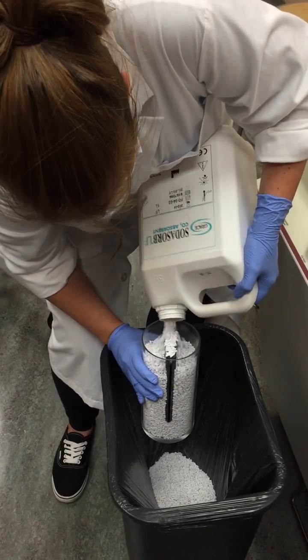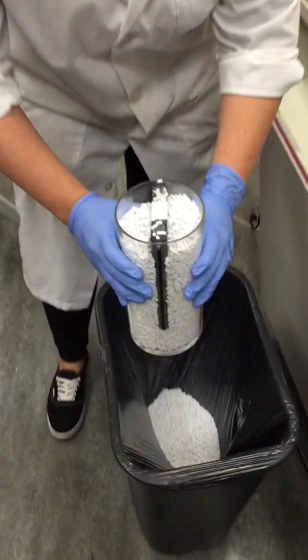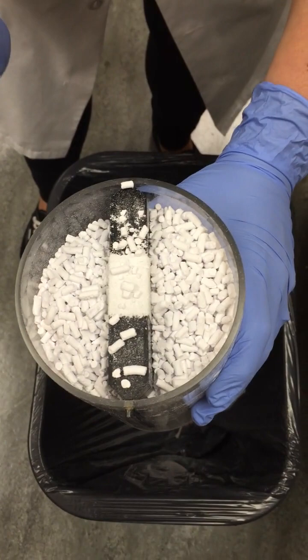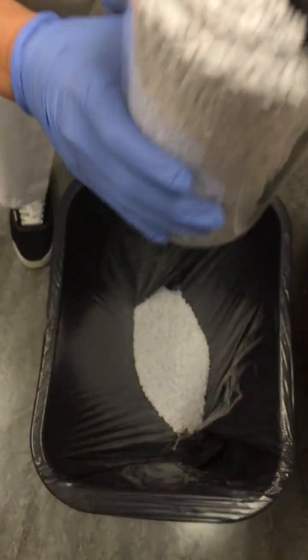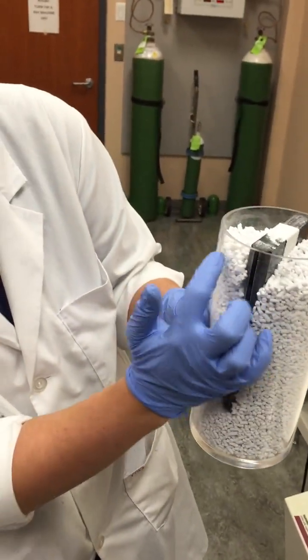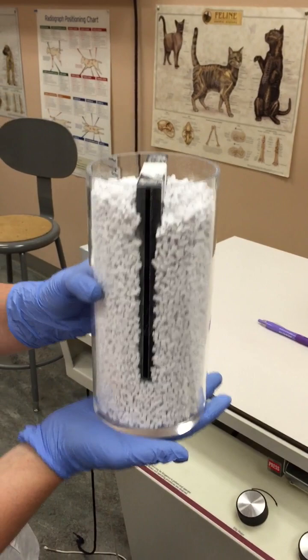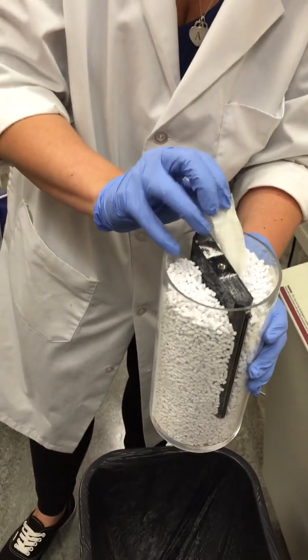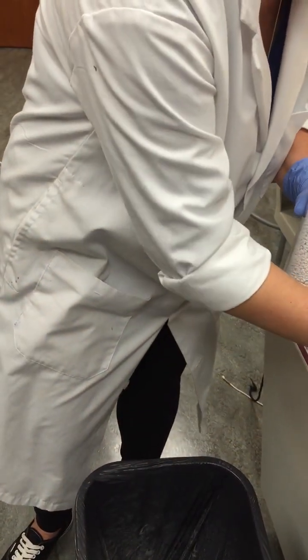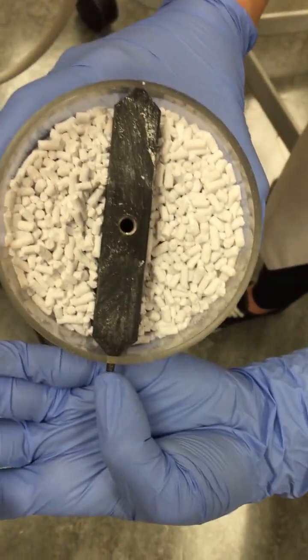And again, we're going to fill it almost to the top. Okay, so see how the granules are on top of where that hole would have been? That's why it's very important to cover that up with a piece of tape. Okay, so if you can see, you want to try and get it almost as equal as possible and about that high from the top. So now I'm going to peel that piece of tape off.